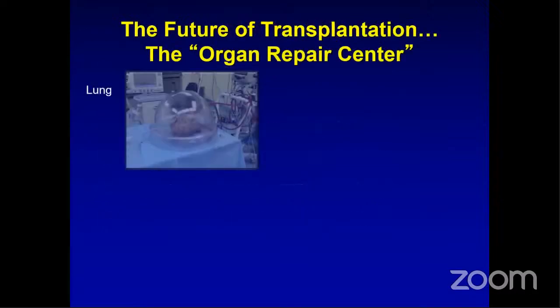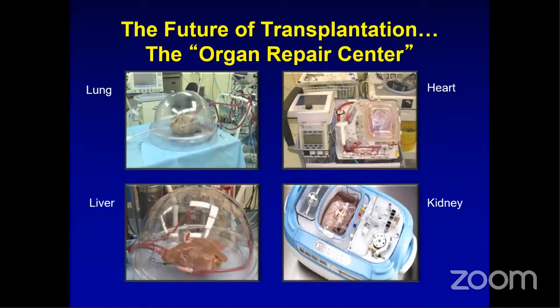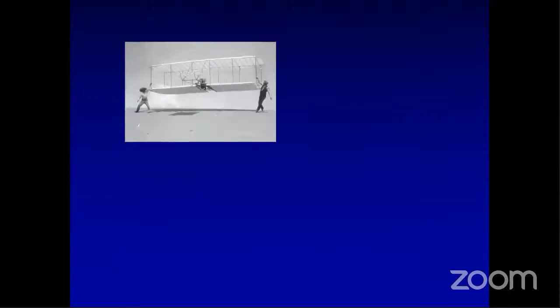So of course, the future hopefully is an organ repair center. The way I see it 10 years from now is we don't anymore get phone calls at night and decide on organ quality based on some data. At the moment I get a phone call at 2 o'clock in the morning and I will decide if a liver or kidney is good or bad based on some information. In the future, hopefully we bring the organs to your center, we put them on the pump, we study them, and we can decide on organ quality based on results, on information obtained from these organs while they are pumped and while they are perfused.